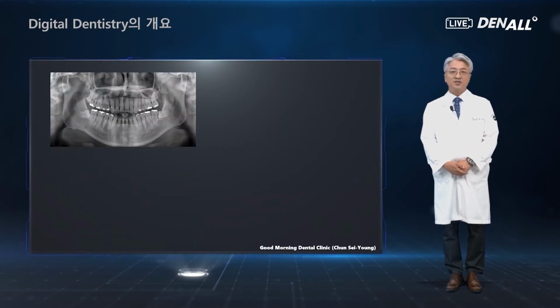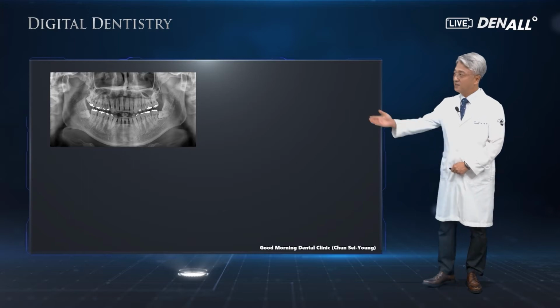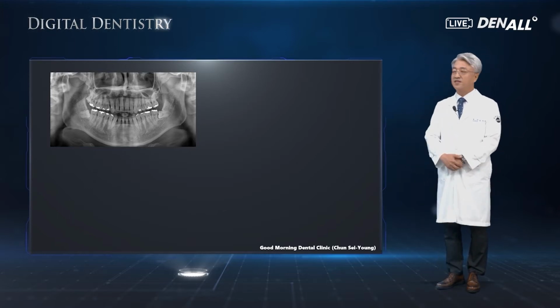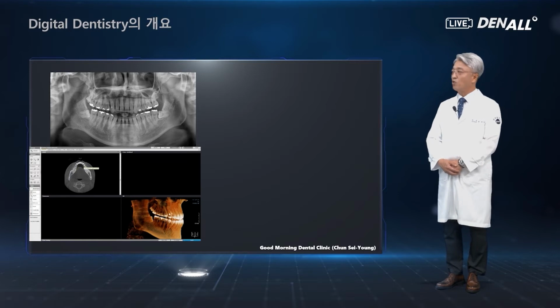First, digital treatment has been widely used in dentistry through technology like the panoramic view. As you can see, the wisdom tooth is diagnosed through the X-ray 2D image. Extraction or other treatment can be decided in this process.